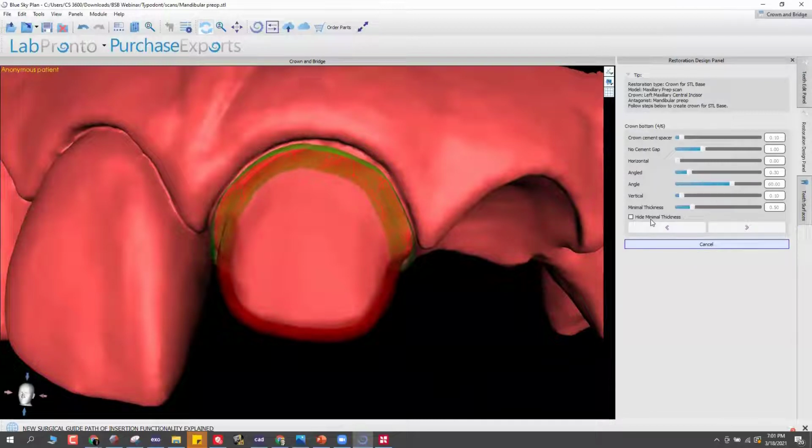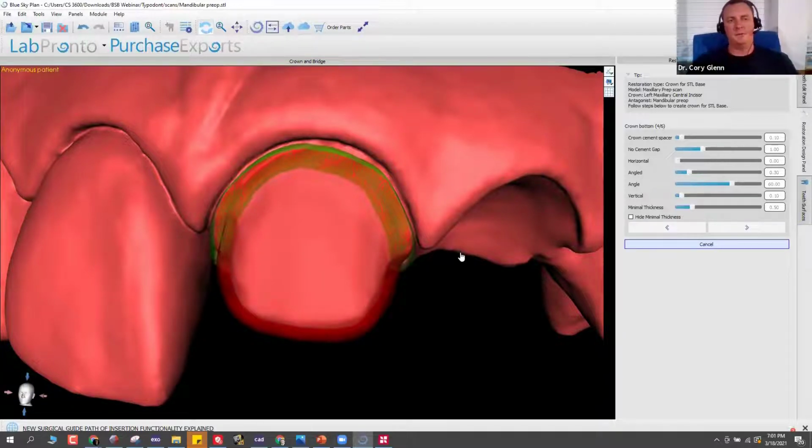Okay. Last two questions are regarding a measuring tool and a copy tool for the teeth. Yeah, don't have them yet. Those will be in subsequent builds. In fact, I just yesterday or the day before went through a big thing with Michael about kind of a biocopy function. If you had a scenario like this where you had perfect preoperative teeth and you just wanted to mimic those, then that's a desirable thing. So you can't do it yet, but that's coming. Again, it's a matter of time and programming. So we'll get there.